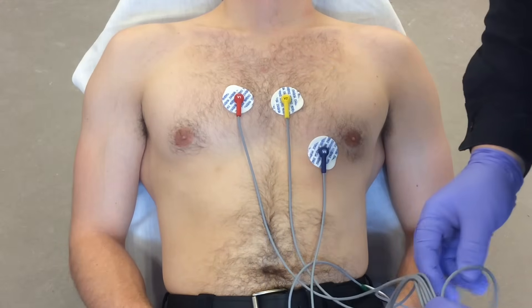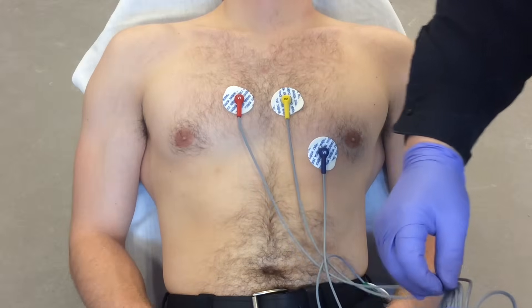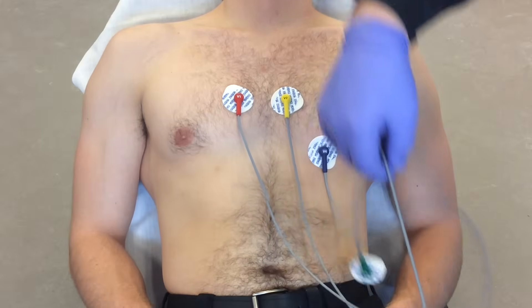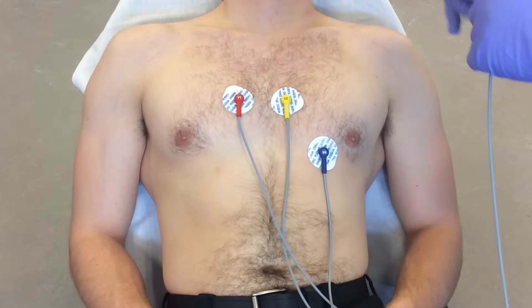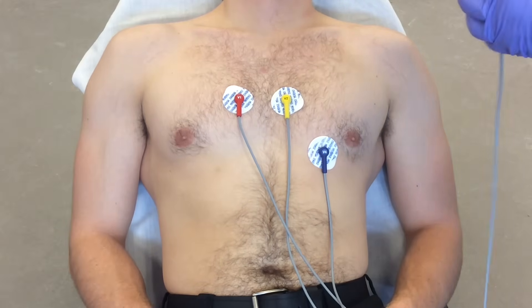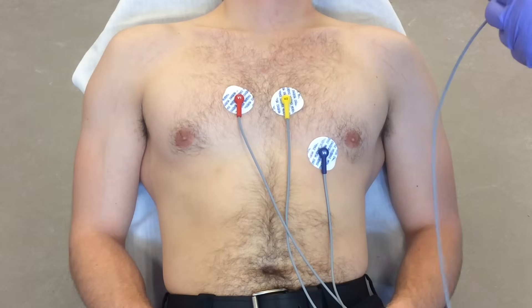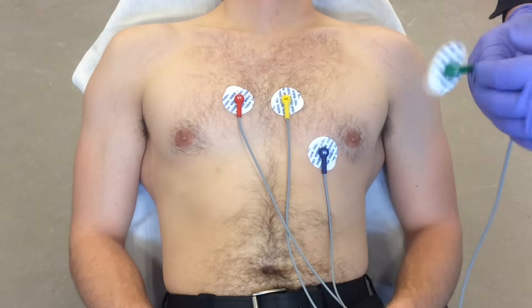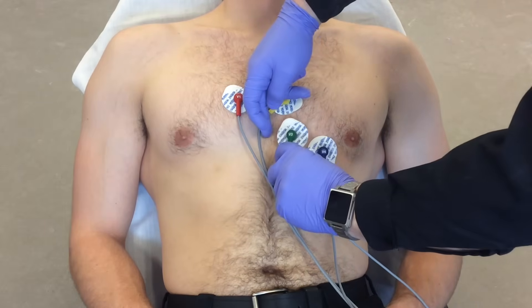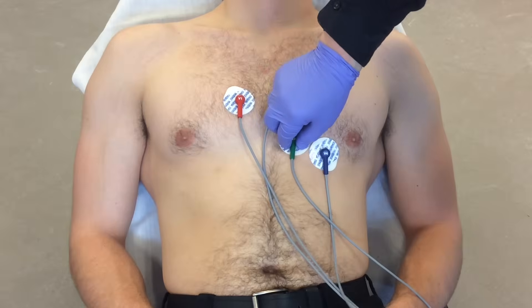And then V3 goes right in the middle between V2 and V4 — right there.